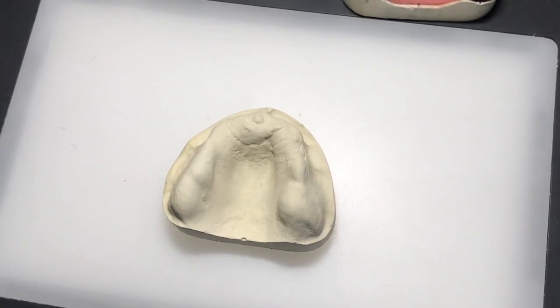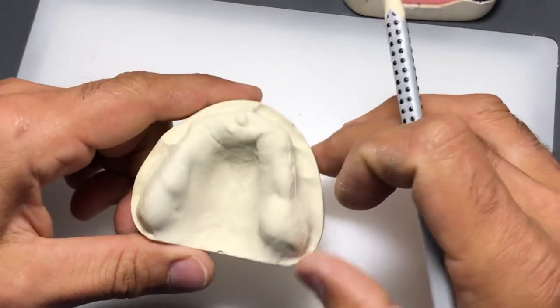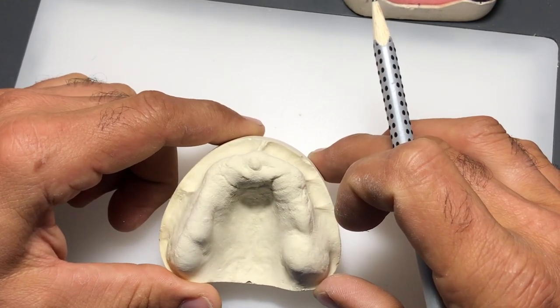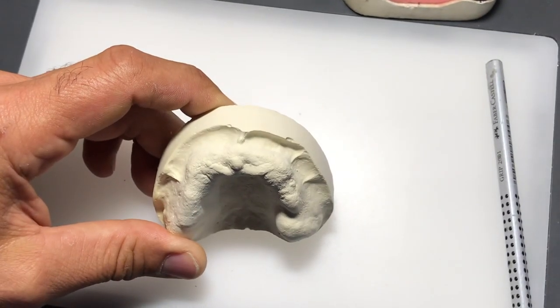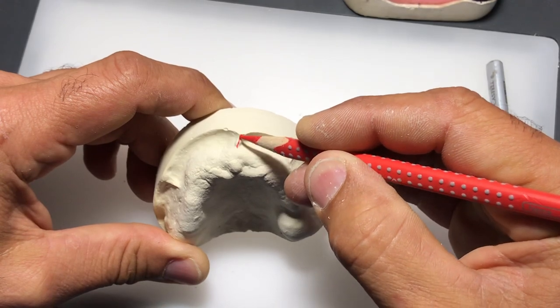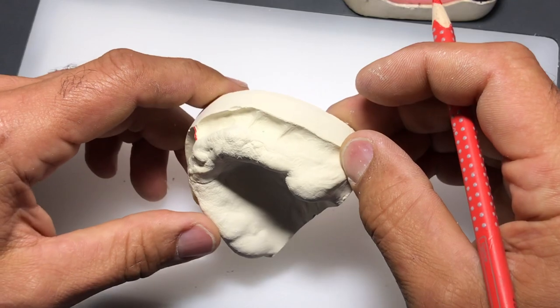The first thing I like to do - and there's no wrong or right way as long as all the landmarks are identifiable - is that the last thing we'll do is outline the extension of our custom tray. So one possible landmark on the maxillary cast is the labial frenumm - this little attachment in front of the model. I'm going to mark that in red pencil. It's very important to identify these frenums because our custom tray must not impinge on them but go around them.